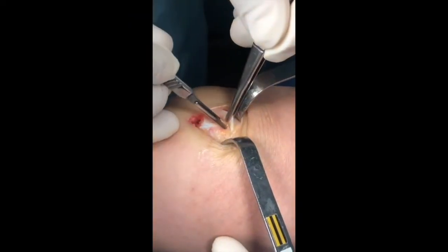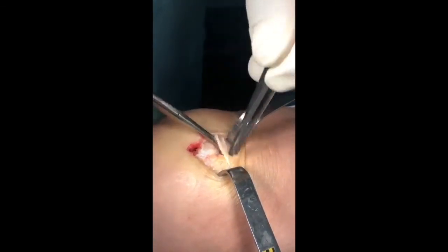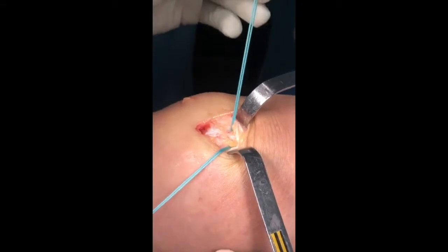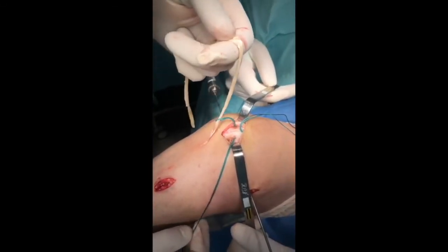A soft tissue tunnel is then created in the medial and distal third of the quadriceps tendon with sharp dissection and a right angle forceps. This tunnel is placed 1.5 centimetres proximal to the superior pole of the patella, close to the midpoint of the MQTFL insertion.